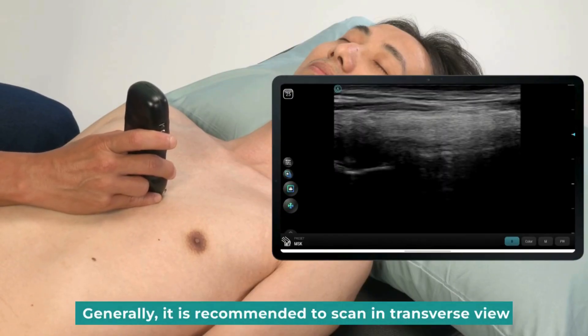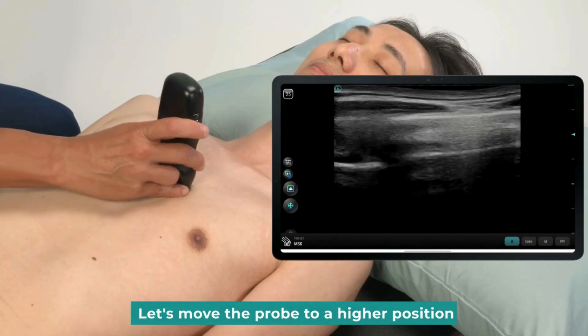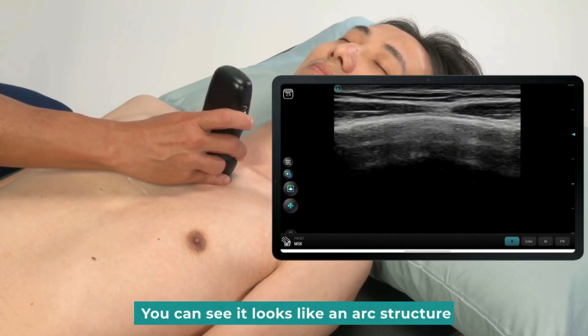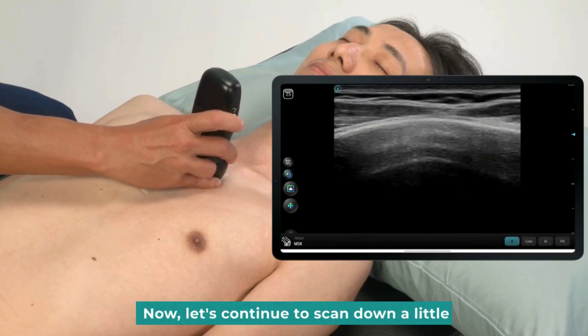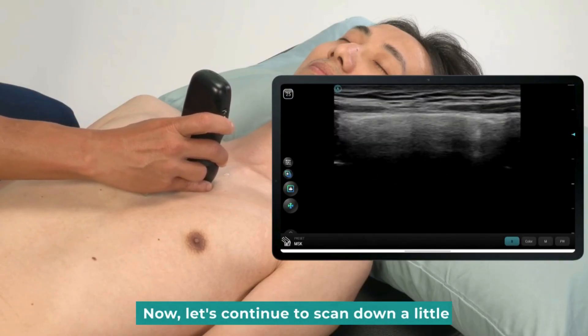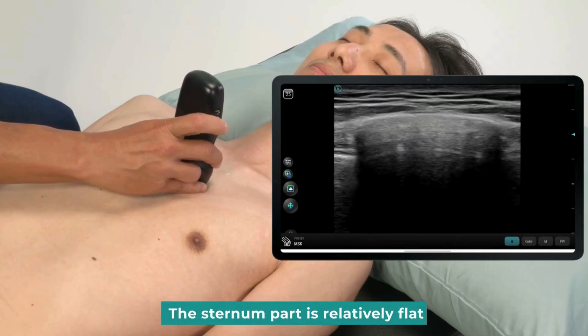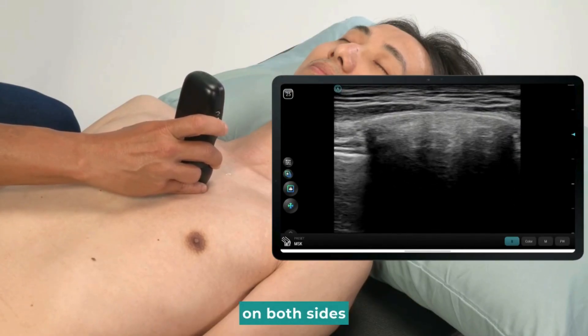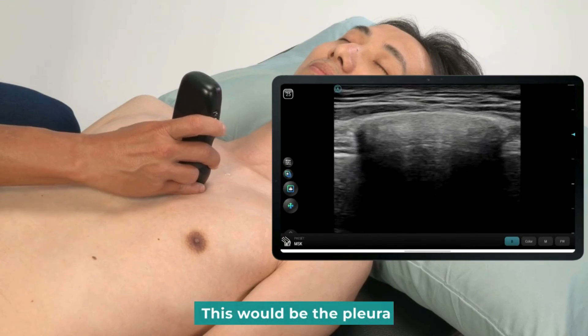Generally, it is recommended to scan in transverse view. Let's move the probe to a higher position. This is the manubrium appearing in the image — you can see it looks like an arc structure. Now let's continue to scan down a little. After passing this junction, the sternum part is relatively flat. We can see a sliding structure. On both sides, this would be the pleura.